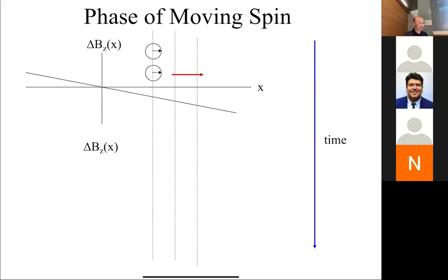Okay, so let's just give you a sense of how we image flow with MRI. Once again, like last time, we're going to consider two spins, A and B. We're going to assume that spin A stays stationary and spin B is moving. And instead of random motion like we did last time, we're going to assume that there's a flow, a velocity in a certain direction. And what we want to do is measure that velocity. Okay. So A is going to be stationary, B is going to be moving at a certain velocity.